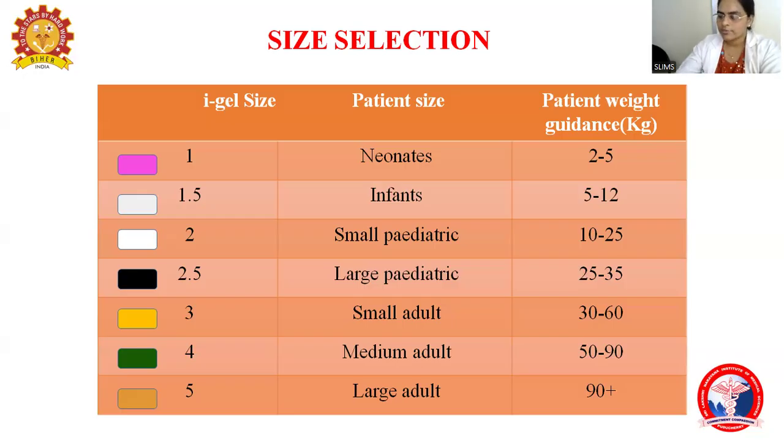And more than 90 kgs, big adults, the larger size 5 is used.